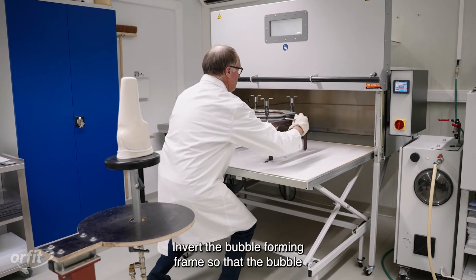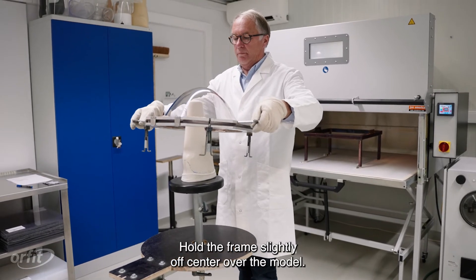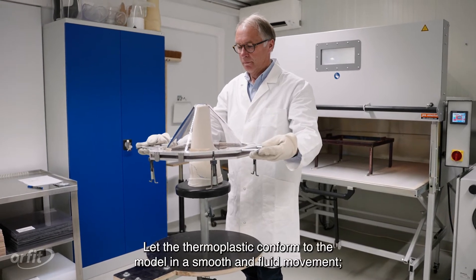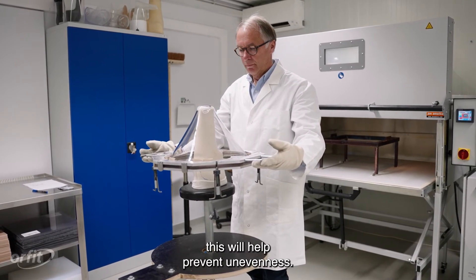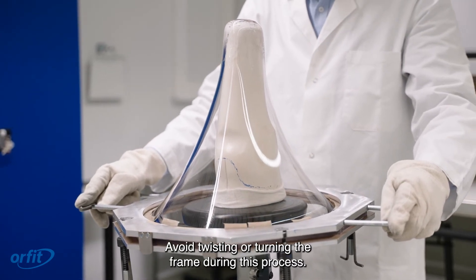Invert the bubble-forming frame so that the bubble is convex-side up and concave-side down. Hold the frame slightly off-center over the model. For best results, allow for more thermoplastic material on the longer, lateral side of the model. Let the thermoplastic conform to the model in a smooth and fluid movement — this will help prevent unevenness. Use light pressure to pull the material straight down. Avoid twisting or turning the frame during this process.